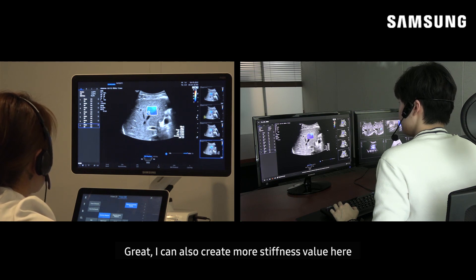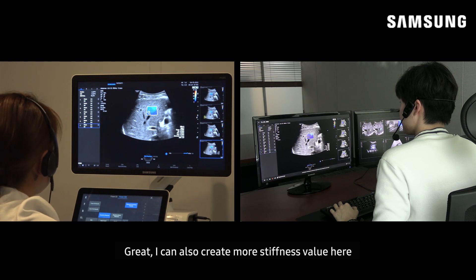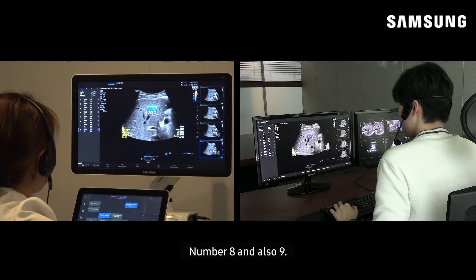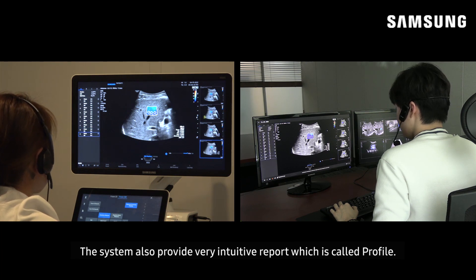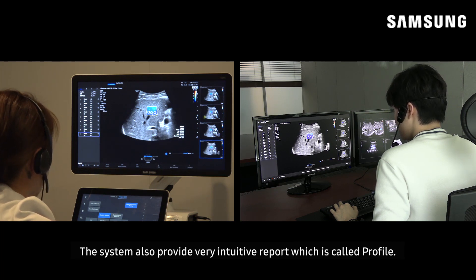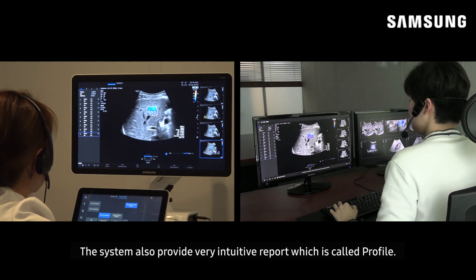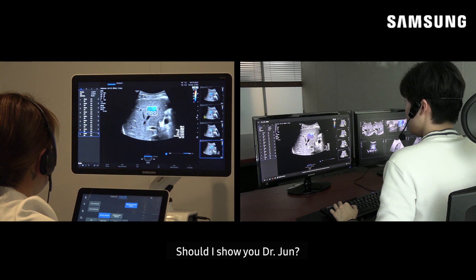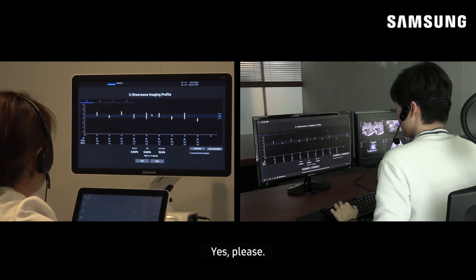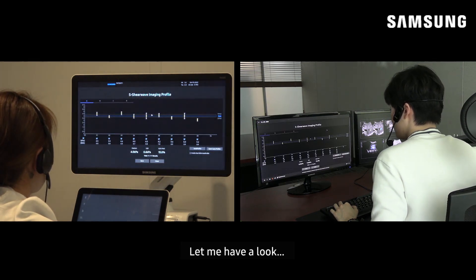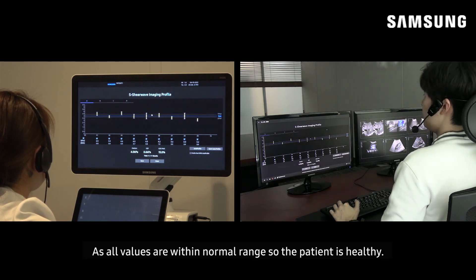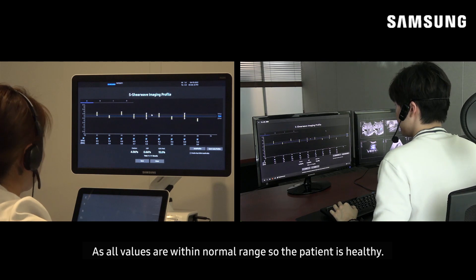Great. I can also create more elasticity values here, number 8 and also 9. The system also provides very intuitive reports, which is called profile. Should I show you, Dr. Jun? Yes, please. Let me have a look. As all values are within normal range, this patient is healthy.